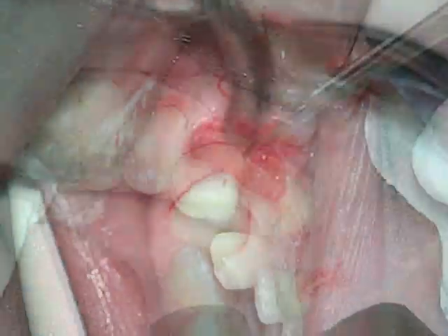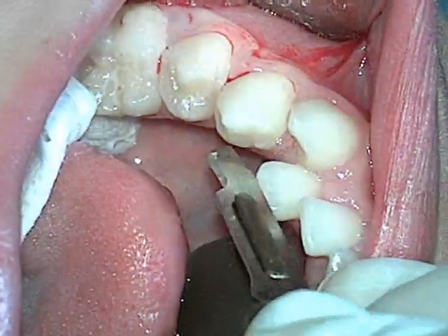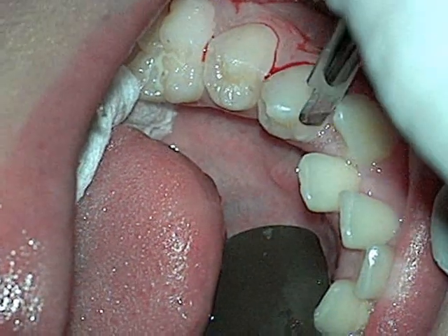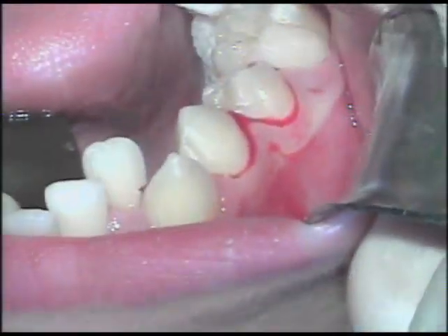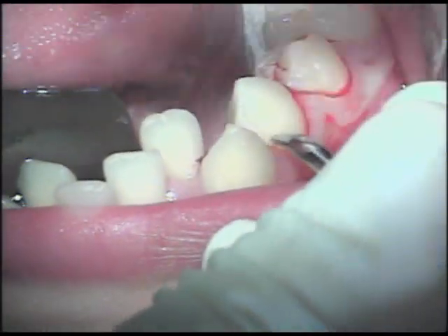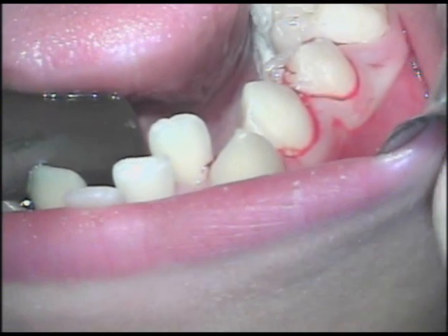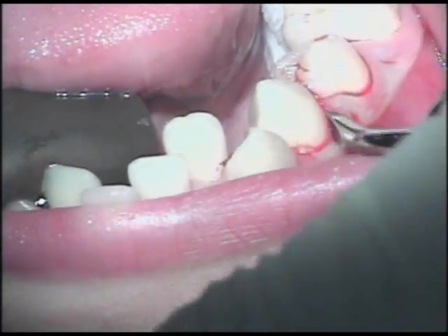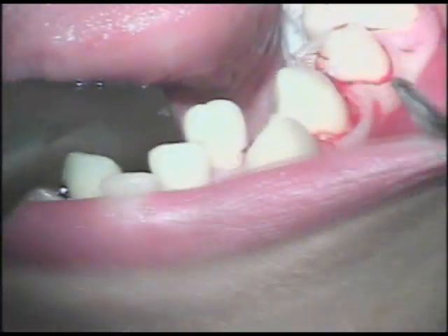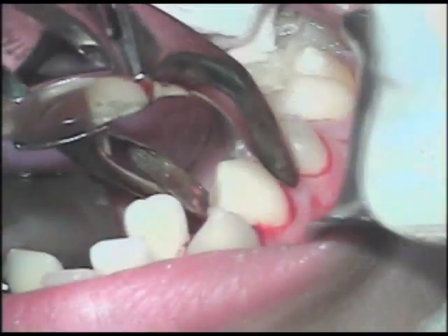Next, we're going to go down to the lower left, where we do the same thing. Again, make a sulcular incision with number 15 blade on the facial and on the lingual. Take the periosteal elevator and just push that tissue back just very slightly. Come back now with a 46R elevator. And now the mandibular roots generally are a single root, as opposed to the maxillary, which may have two roots.